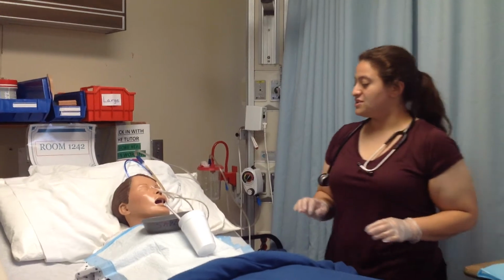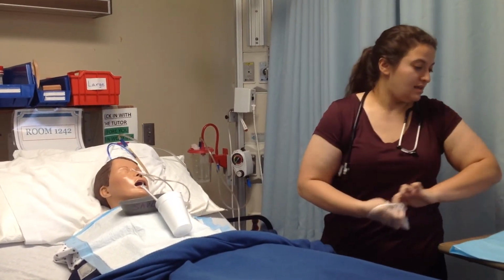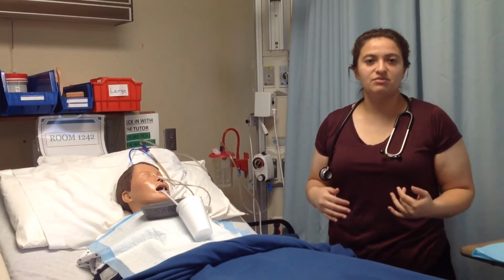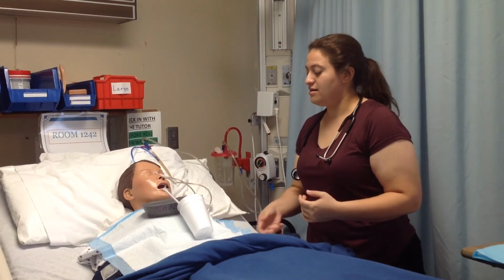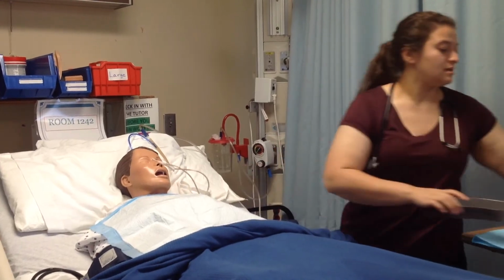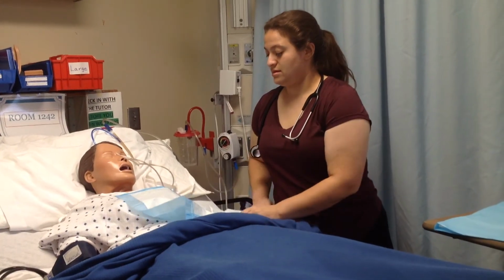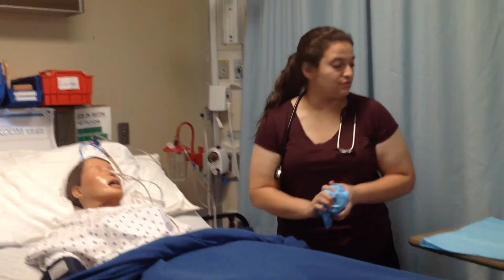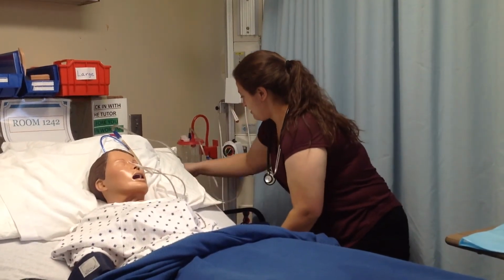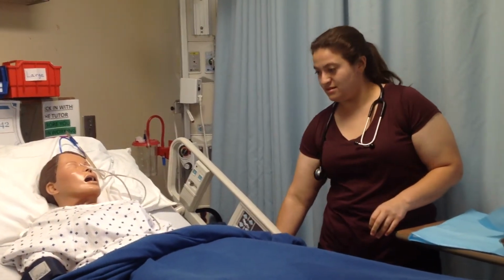I would make sure that's out of the patient's way. And then I would take off my gloves. And I would make sure to clean up my area, make sure that the patient's comfortable. And then I would document any abnormalities. And then I would put this back up. Lower the patient's bed.